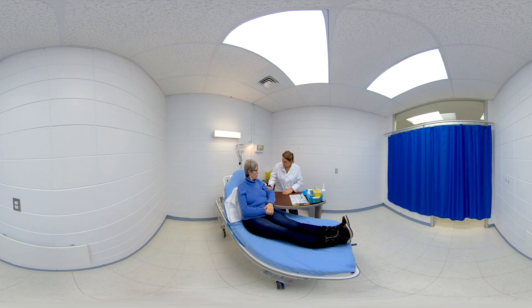Can I use this arm? Yeah, sure. No problem with it? Yeah. Okay, we're just going to need to pull up the sleeve a bit. The laboratory technician must make sure the patient does not have any contraindications relative to the puncture site — for example, signs of infection or an arteriovenous fistula.